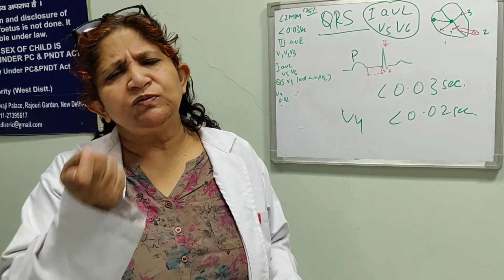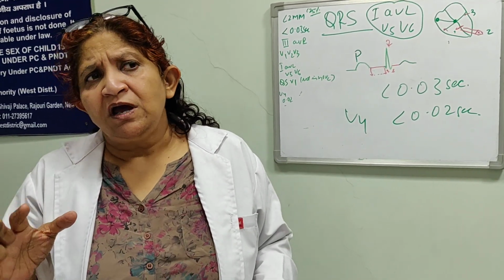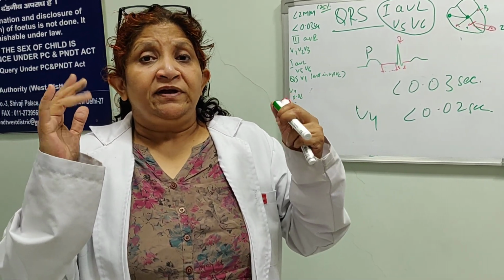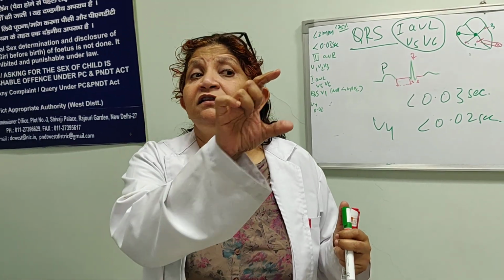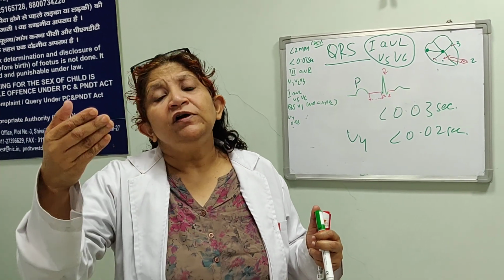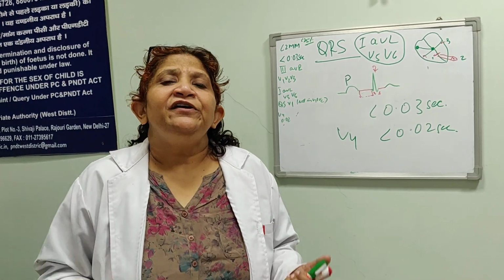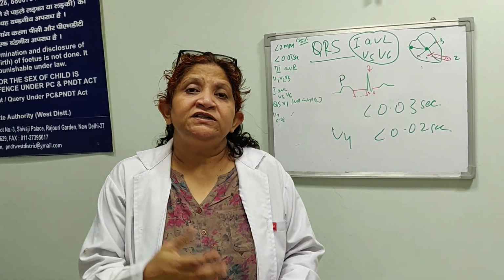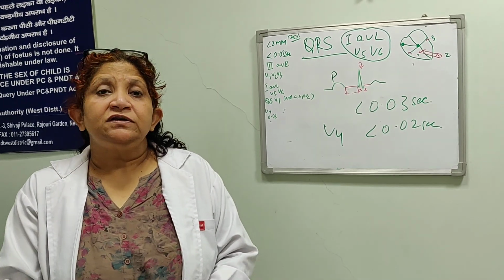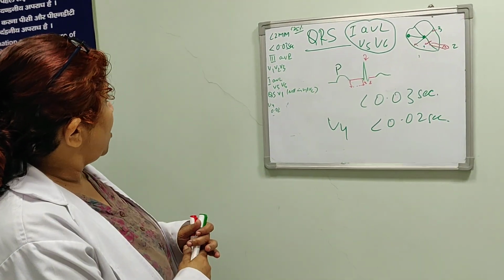And whenever you see some small Q waves in lead 2 along with lead 3, with no symptoms, always ask the patient to take a deep breath like this and hold for some time and take the ECG. You can see in the monitor of the electrocardiograph machine that the Q wave reduces by at least 50% of the size. So these are respiratory Q waves. These are due to diaphragmatic respiratory variation. So you should remember that Q waves are normal in lead 3 and AVR. So that is all about the Q wave.